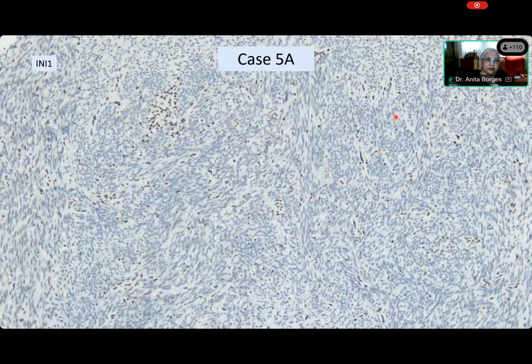Now this is INI1. Okay, and INI1 is also nucleus. Yes, you see it. It's present in some here and there. But what you're seeing here is internal control. The internal control is the vessels. You can see that the vessels shouldn't lose INI1, so that's an internal control. But you see that there are lots of spindle cells that have lost INI1.